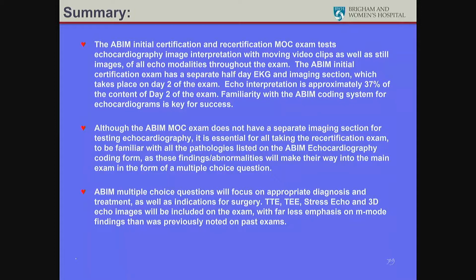echocardiography, it is essential for all taking the recertification exam to be familiar with all the pathologies that are listed on the ABIM echocardiography coding form, as these findings and abnormalities will make their way into the main exam in the form of a multiple choice question.